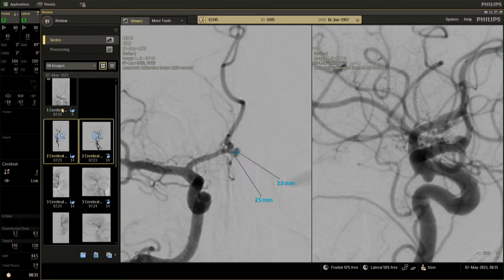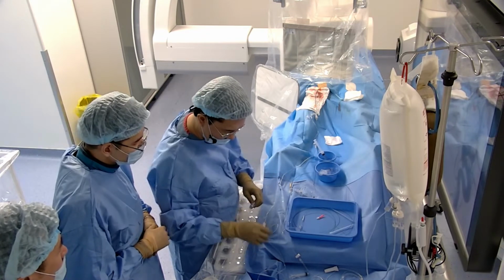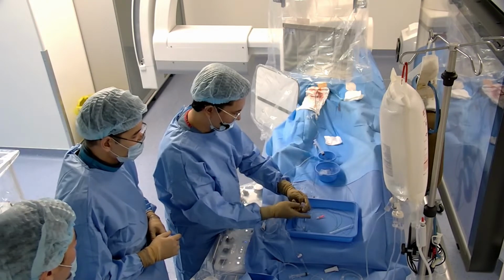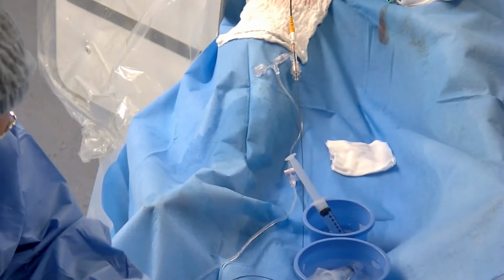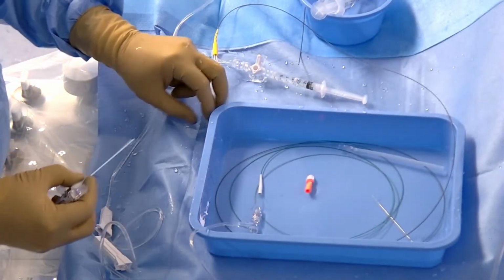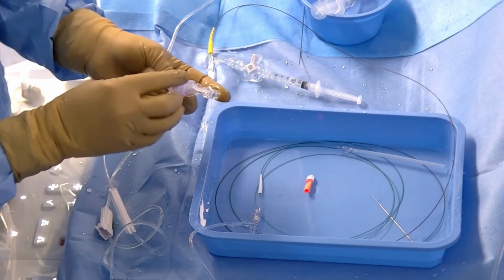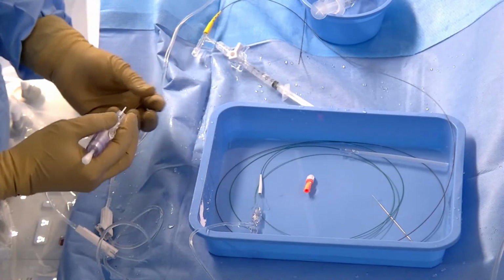Okay, today Yalalta and Sheikh Ahmed are planning to assist me, and they put Chikai Black inside the scepter. It's okay. I think Yalalta and Sheikh Ahmed prepared the scepter balloon, but I need to check because it's a very important part of this treatment.